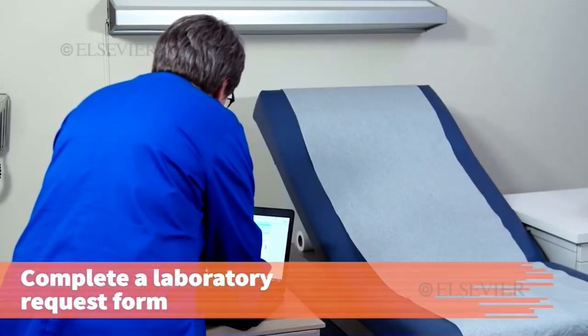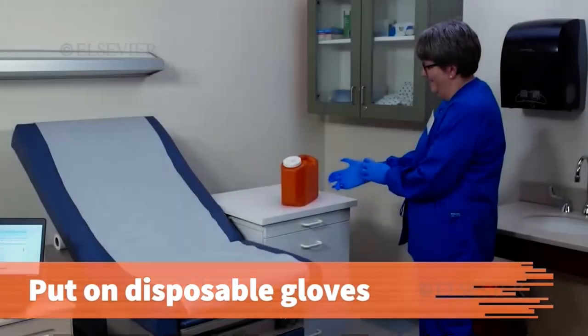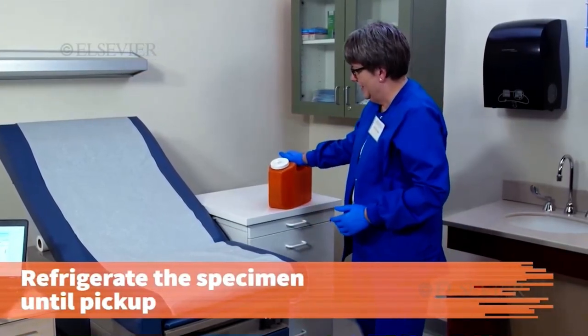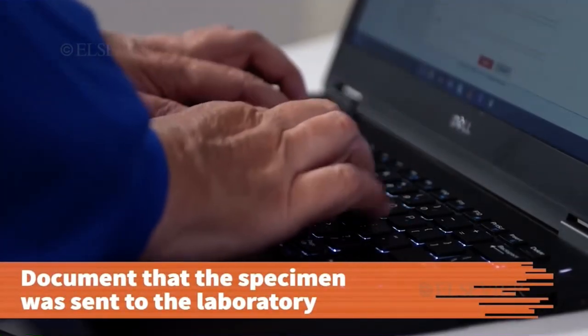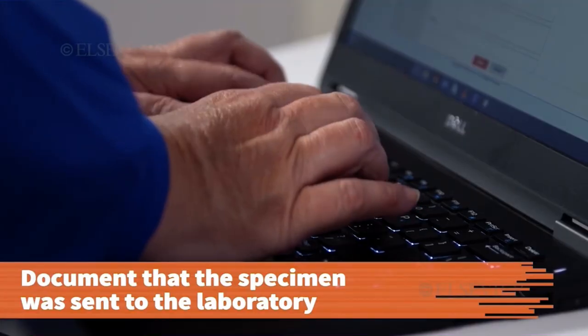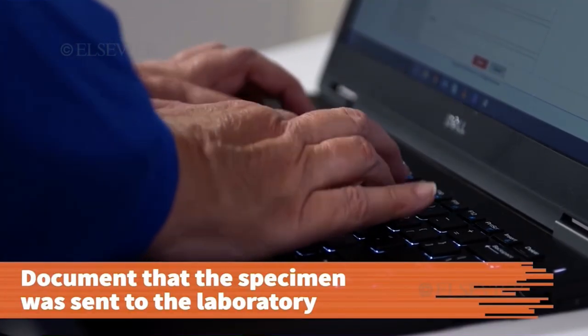Complete the laboratory request form and put on disposable gloves before preparing the specimen for transport. Store the specimen in the refrigerator until it's picked up by the laboratory. Document that the specimen was sent to the laboratory, including the type of test ordered, the date and time, the type of specimen, and your initials.